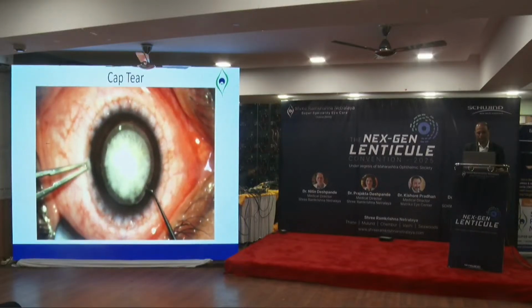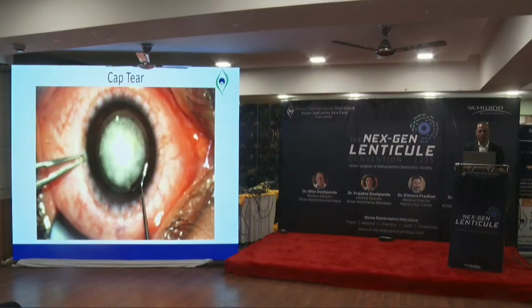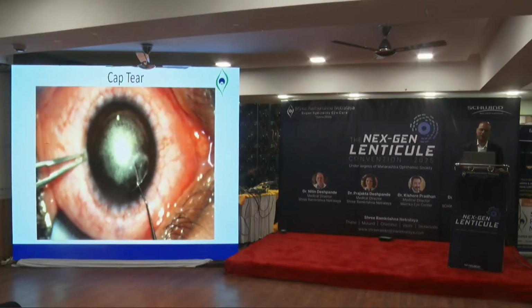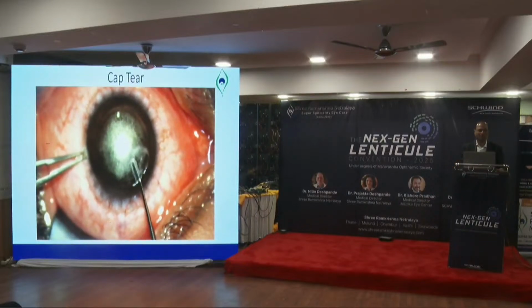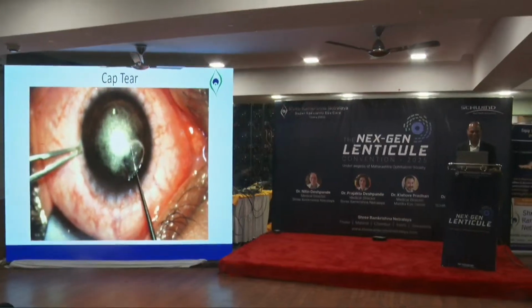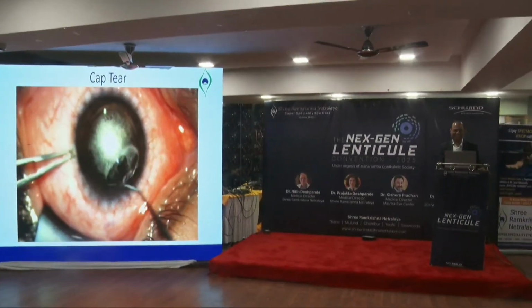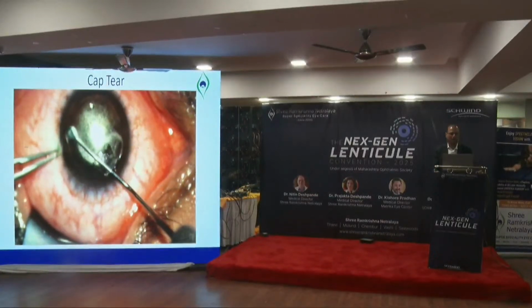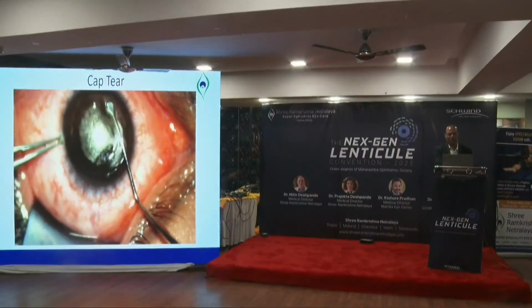And the final one, similar to the last. So this was a very recent case. After Dr. Kishore showed that he gets a cap tear, then I don't feel guilty at all getting a cap tear. This is a fairly recent case. See, cap tear there.